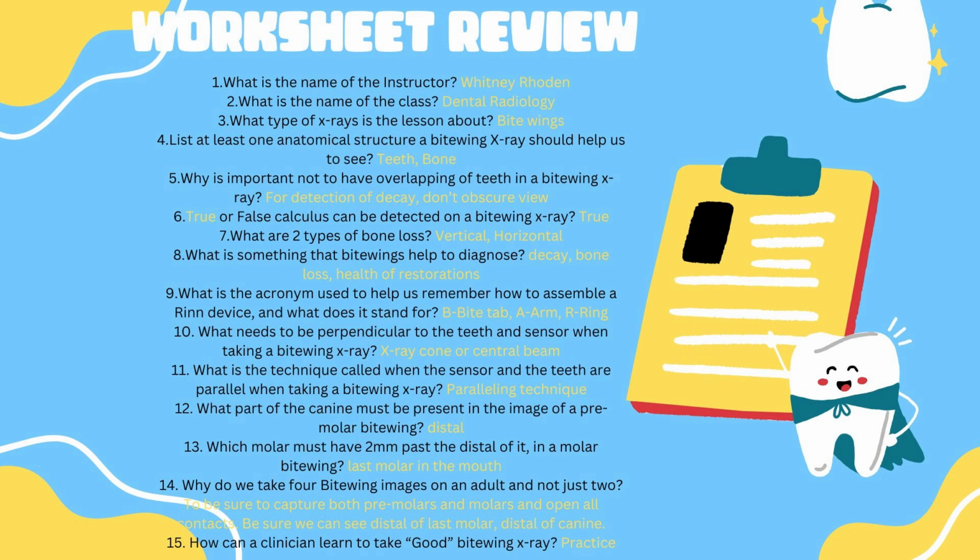Number 10, what needs to be perpendicular to the teeth and the sensor when taking a bite wing x-ray? Well, the x-ray cone, or like the central beam that runs through the x-ray cone, needs to be perpendicular. Number 11, what is the technique called when the sensor and the teeth are parallel when taking a bite wing x-ray? It's called the paralleling technique.